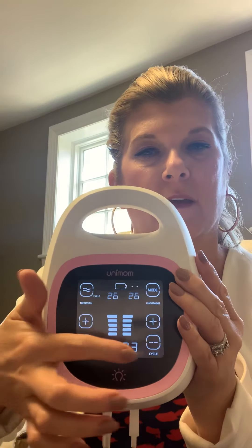You can also do synchronous mode. This is your vacuum strength and this is your cycle speed. And then you've got your nightlight — three settings for the nightlight, right here. It's really small and compact. Super unique pump.